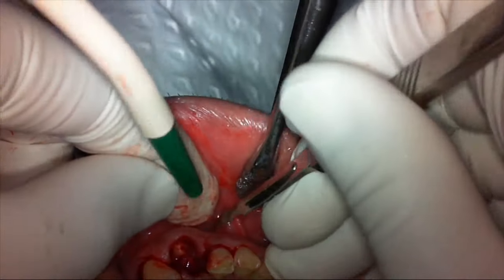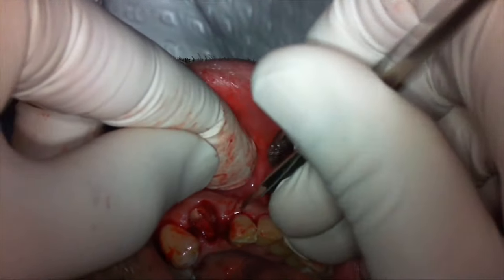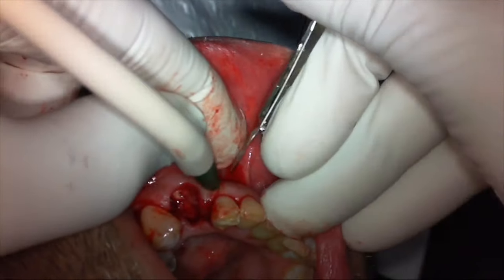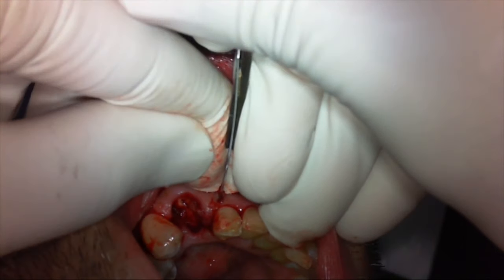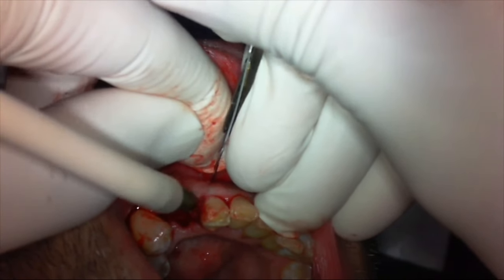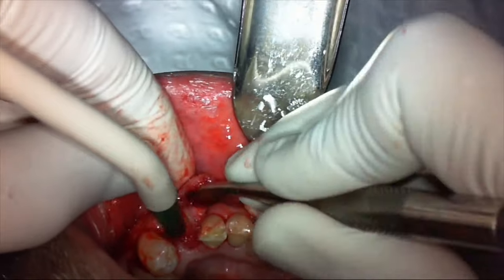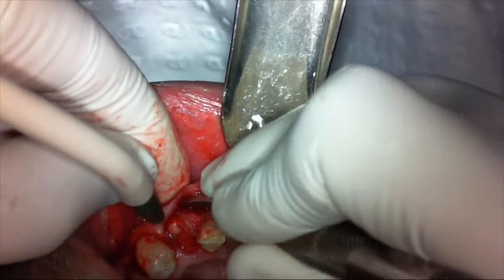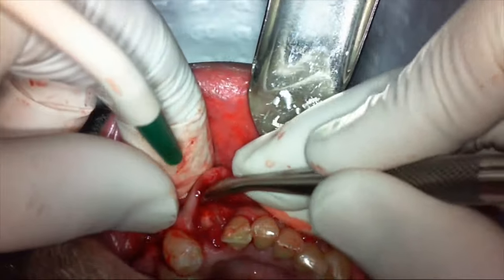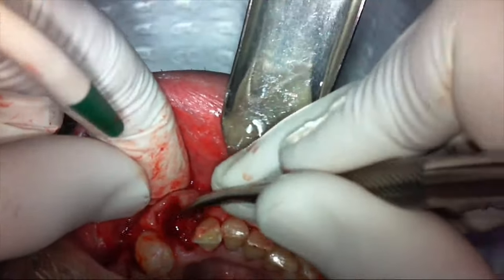That is a vertical releasing incision on the mesial. Now elevating and reflecting the flap. When there is some granulation tissue, it can feel a bit of resistance from the attachments. The tissues can be very friable as well, so you have to be very cautious, gentle, and take your time.